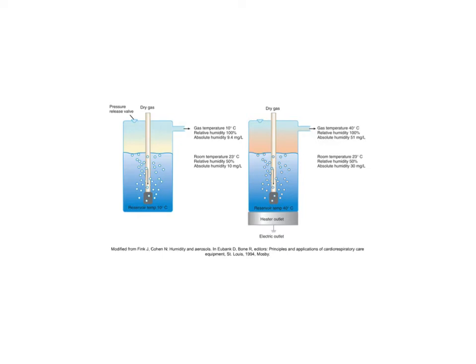We'd start to call a rapid response if all of a sudden their oxygen needs changed, because at 6 liters per minute, they can no longer be on the floor. They need a higher acuity of care, whether it's a step down unit or an ICU. So these are going to be mostly for low flow and not heated.